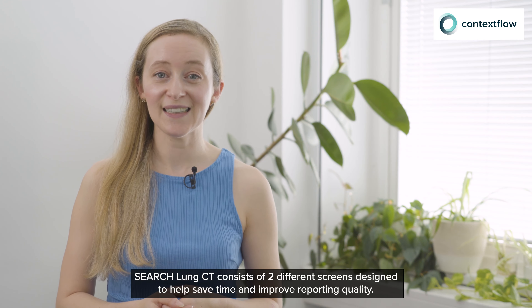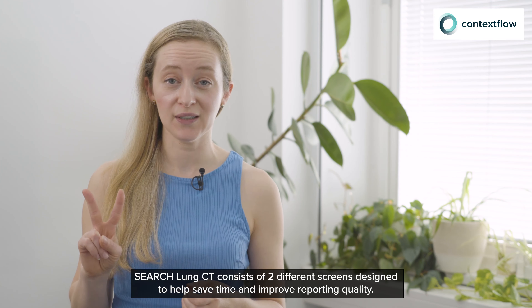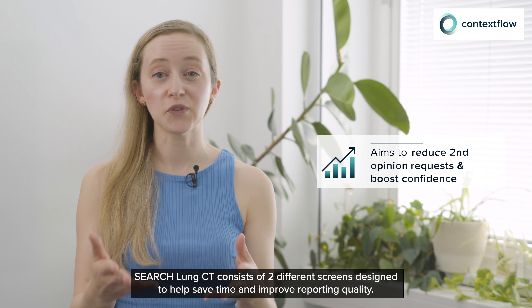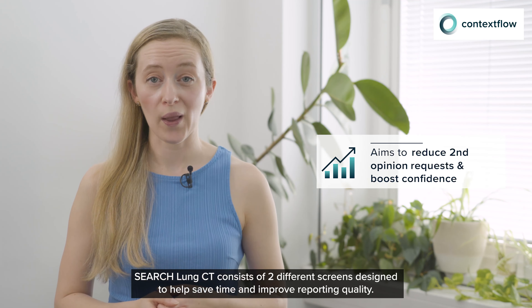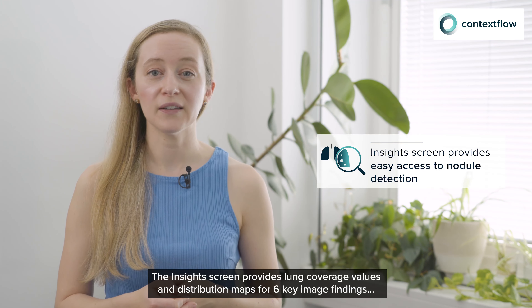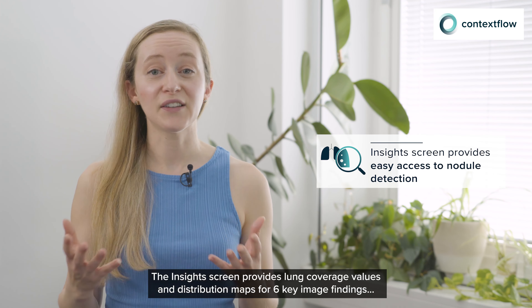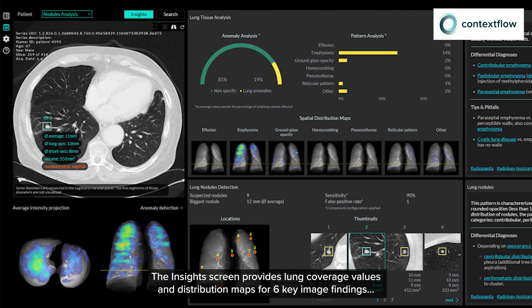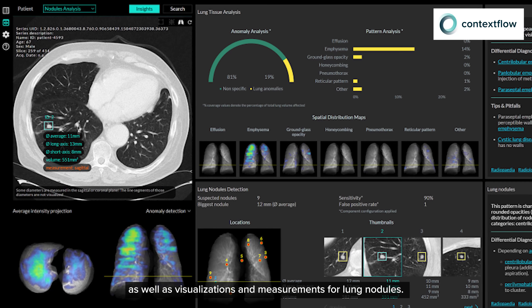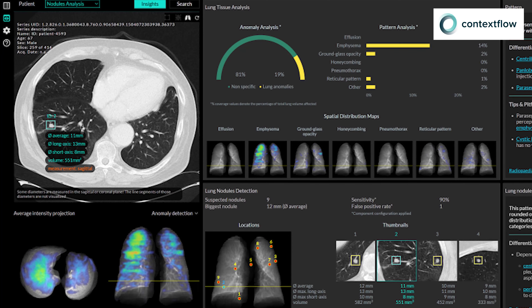Search Lung CT consists of two different screens designed to help save you time and improve reporting quality. The Insight screen provides lung coverage values and distribution maps for six key image findings, as well as visualizations and measurements for lung nodules.